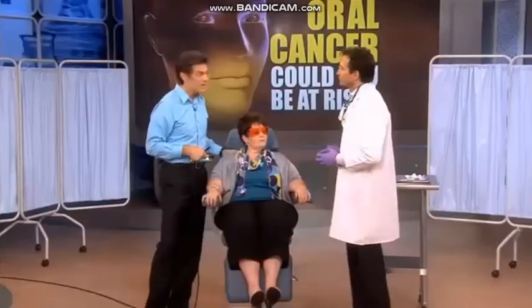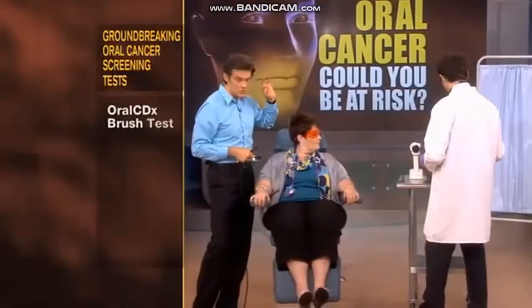And I love this again because I hate the idea of a doctor having to take a knife and scrape stuff that's not really bad in your mouth. And so this is a brush technique. If you don't mind explaining, it's called the oral CDX brush test. If you could demonstrate it, I think everyone should have this also. It's a quick way of making sure you don't have anything going on.